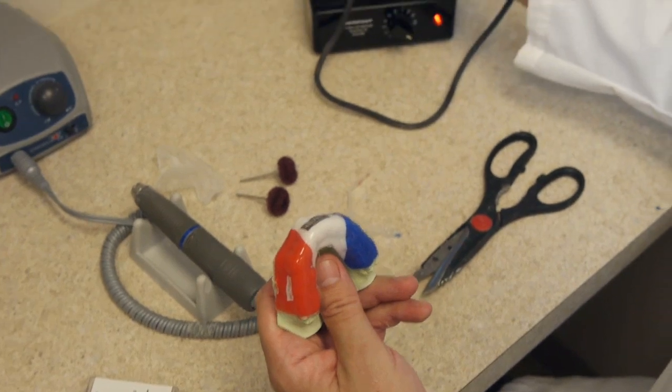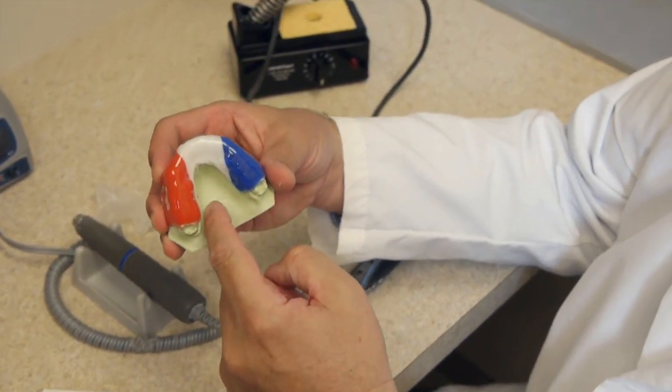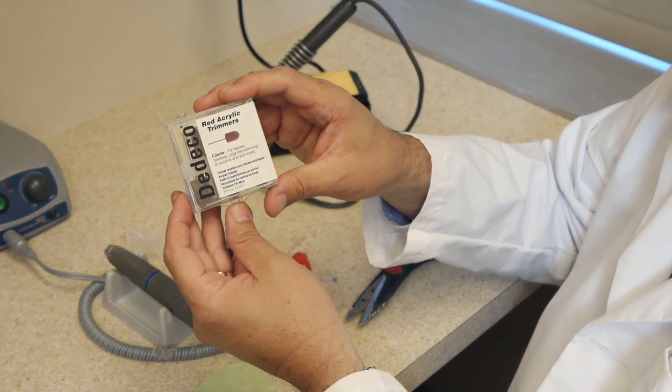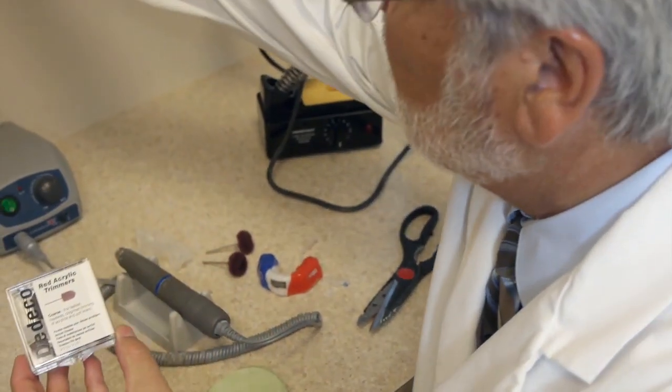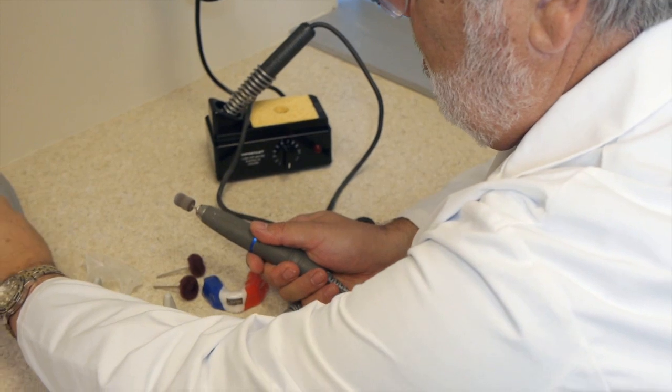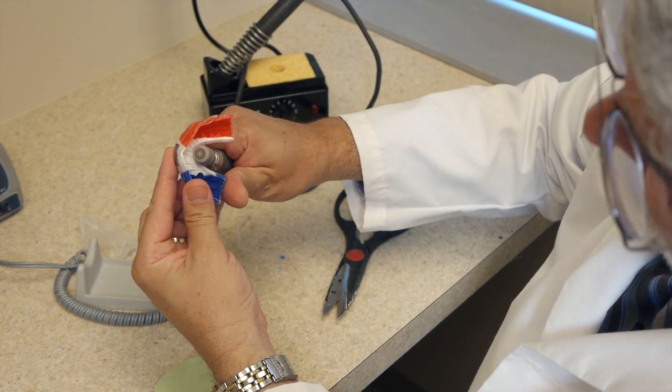Now this last part is very key. We're going to trim this right to the teeth, and then I want a feather finish right here so the athlete doesn't feel a bulk material of mouth guard lingually. They don't want to feel like there's something back there. They want to be able to talk as clear as I'm talking now. You don't need the thickness lingually - you need the thickness labially. So we're going to trim this portion now. I'm going to use my red acrylic stone trimmers. And again, we're going to trim right to the teeth.